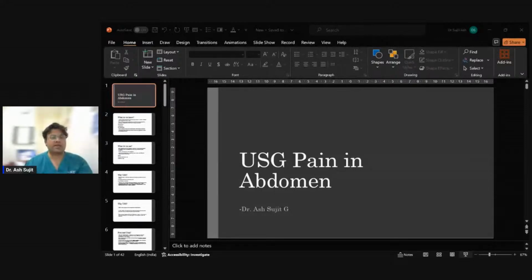And that is why we are having a discussion as gynecologists on why ultrasound becomes important. Obviously, ultrasound will have its pros and cons like anything out there today. The other imaging studies that you think about are CT and MRI. But ultrasound and MRI are the only two modalities which have non-ionizing radiation for the patient, and that is why it's important in the reproductive age group. Ultrasound also is very easily available everywhere. You might find an ultrasound machine, but not a CT or an MRI system. And it is comparatively cheaper when you compare it with CT or MRI.